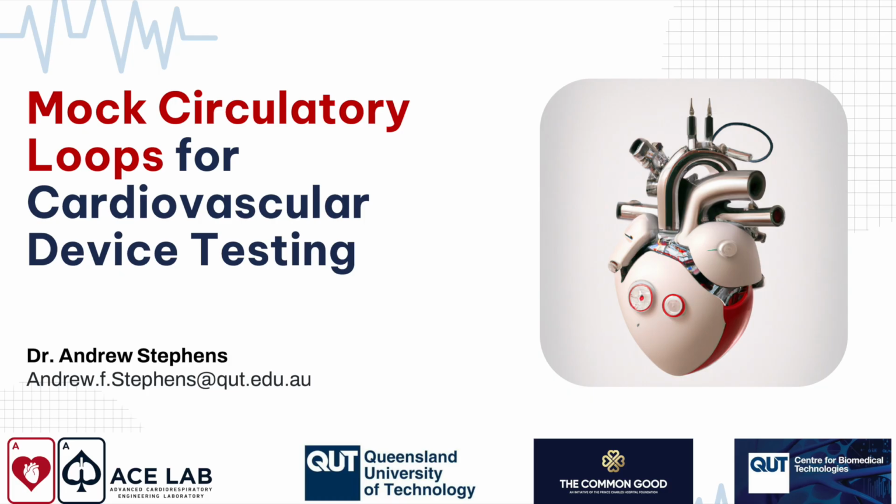And that one's actually controlled by pneumatics. So essentially what we have is we allow the ventricle to fill up, and then we use a shot of compressed air to push the fluid down, and then the valves control the forward flow through the ventricle. And that's how we create our heartbeat and cardiac output.